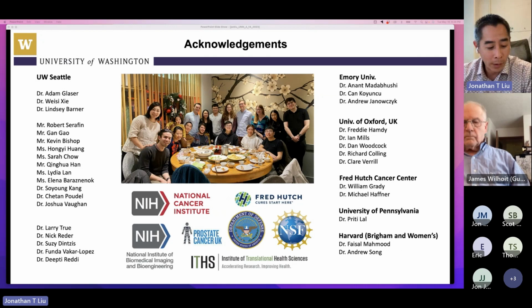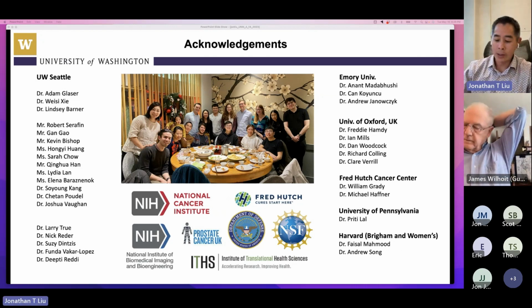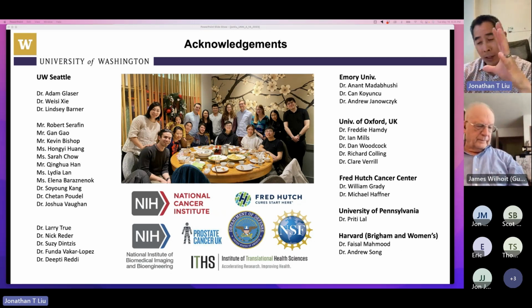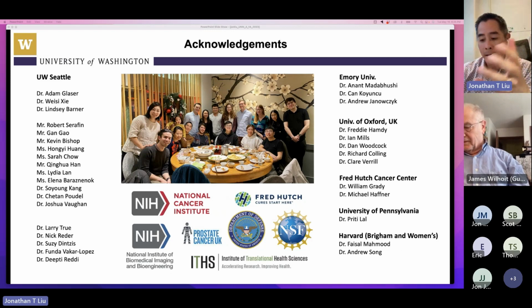There's been a lot of work done over the last few decades to develop these neural networks, and they are just a series of convolutions. They're downsampling the data, connecting the different pixels. When you have an image, it's basically an array of values that represents the intensity of each point in the image. And so they're trying to figure out relationships between different pixels within the image that persist for diseased tissue versus non-diseased tissue.